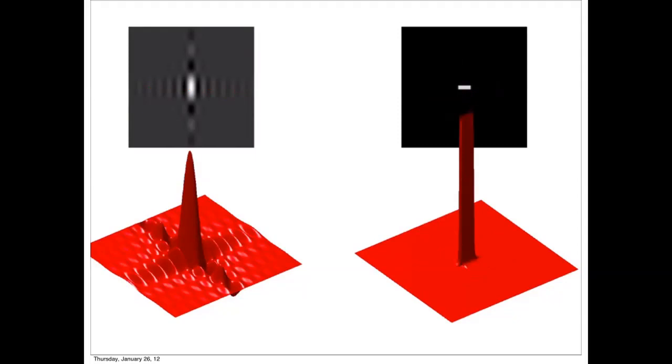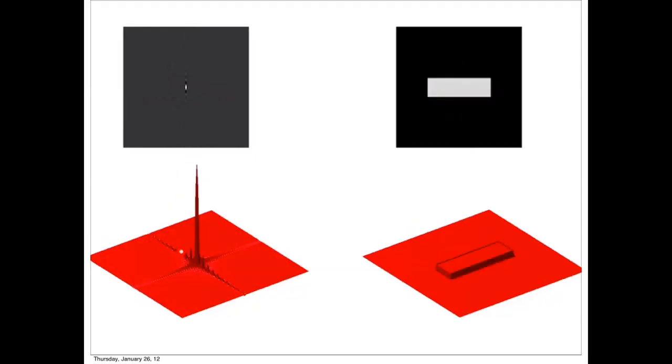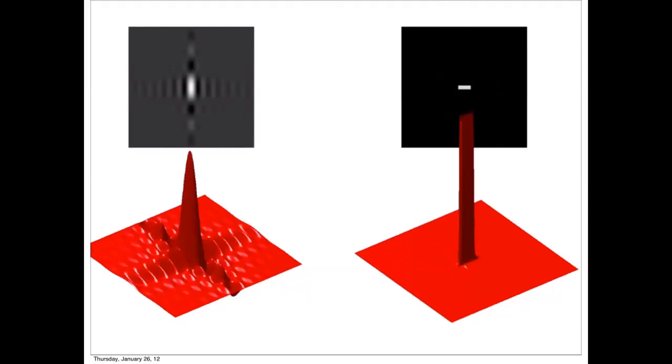Do you see the difference? This is like a sinc that goes for a long time, very narrow. And this is kind of like a stretched one. And then you can see this is the result.